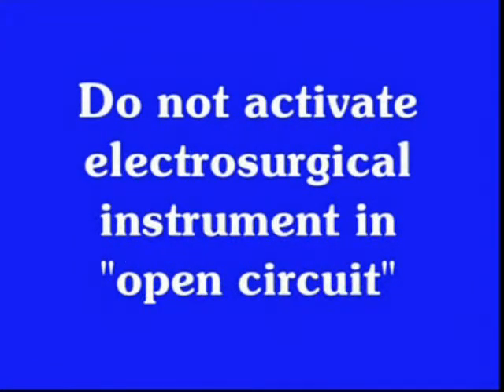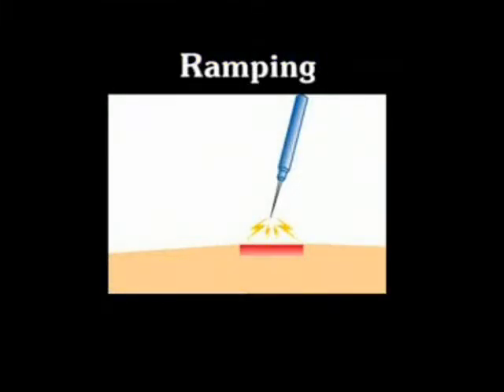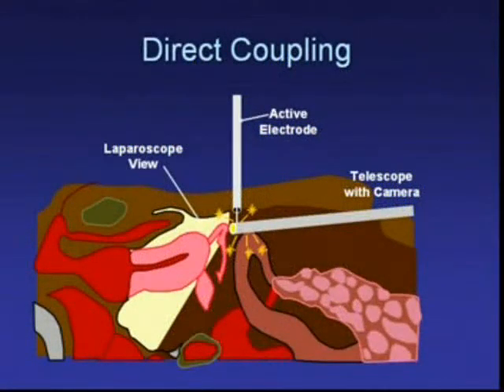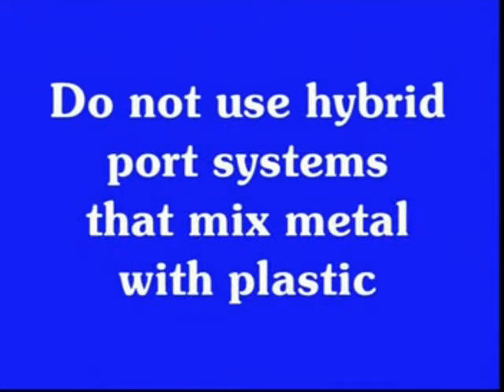Do not activate the instrument in open circuit, that is, when the instrument is not either in contact with the tissue or within very close proximity when fulgurating, as this can cause what is termed ramping. This is when the charge on the instrument builds up to dangerous levels and then suddenly discharges to the tissue, causing severe burns. Do not activate in close proximity or direct contact with another instrument. Remember the concept of direct coupling. Select an all-metal or all-plastic port system as the safest choices, and remember, do not use hybrid port systems that mix metal with plastic.